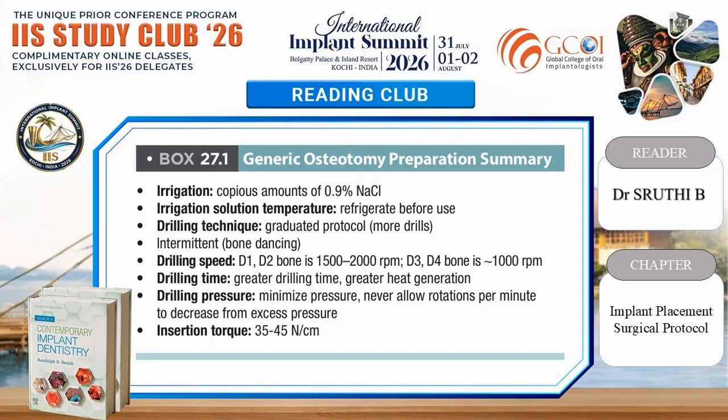Drilling speed, D1, D2 bone is 1500 to 2000 rpm. D3, D4 bone is approximately 1000 rpm. Drilling time, greater heat generation. Drilling pressure, minimize pressure, never allow rotations per minute to decrease from excess pressure. Insertion torque, 35 to 45 Newton centimeters.